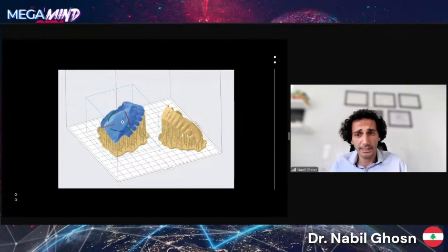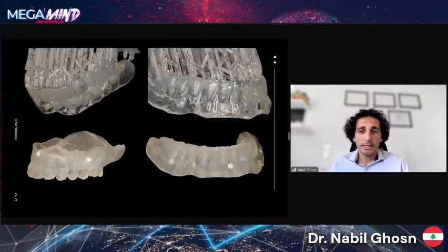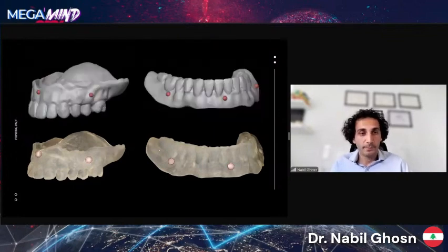Those are the alignment devices in the pre-form slicing software, and the alignment devices printed, and then we bonded the radio-opaque markers of flowable composite in their indentation sites. This is now a comparison between the digital and the physical version of the digital alignment devices.